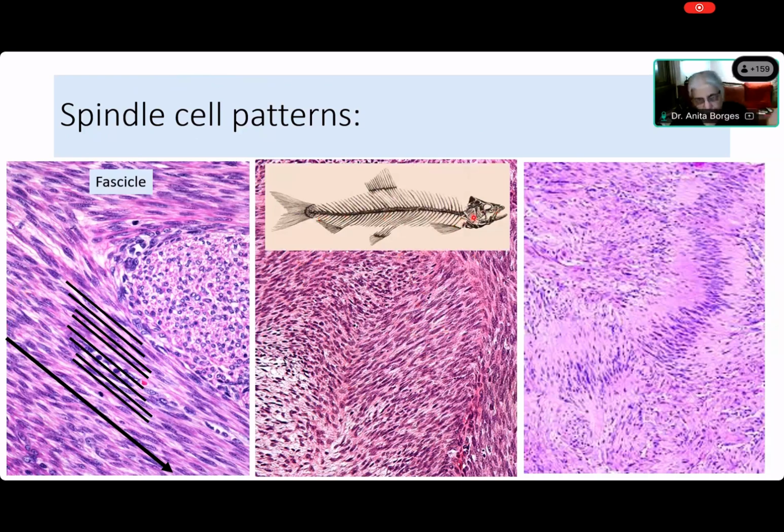They call it, you can take any other fish which has what? It's got a spine, and it has got bones that are deflected away from the spine, but not at right angles. They are deflected away in an angular fashion. Now can you see it, Diksha? Yes, ma'am. Where? Here, lower down. Very good. That's the spine. Excellent. And now you are able to see.